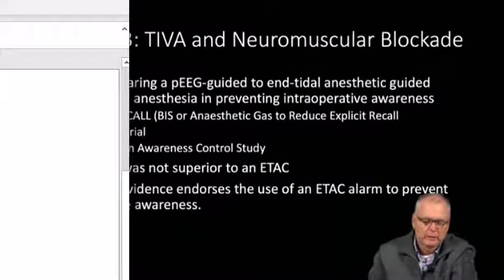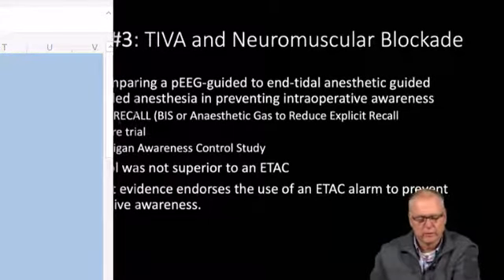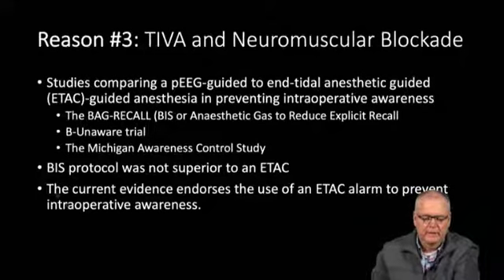There have been several studies like this: BAG-RECALL, B-Unaware, the Michigan Awareness Control Study. All of them found that a BIS protocol was not superior to end-tidal anesthetic-guided anesthesia. And the current evidence endorses the use of end-tidal anesthetic concentration alarms to prevent intraoperative awareness.